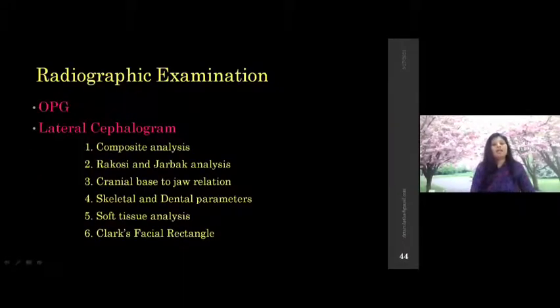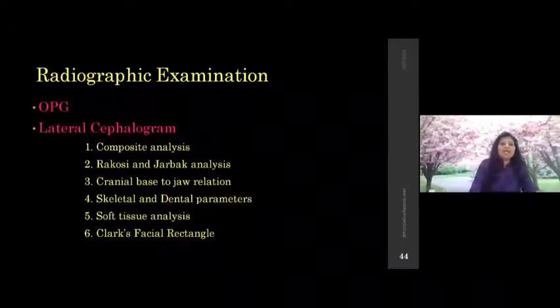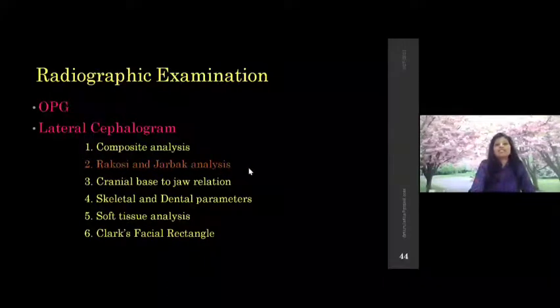Then radiographic examination. You are supposed to examine the OPG as well as the lateral cephalogram. In the OPG, you will check for the presence of all teeth. You will also check the eruption status. You also check the mandibular canine calcification, so that you will come to know the growth status of the patient. In the lateral cephalogram, you're supposed to do all the analyses which I have listed here, but one analysis which has to be mandatorily done is the Rakosi-Jarabek analysis. This analysis is supposed to be done.